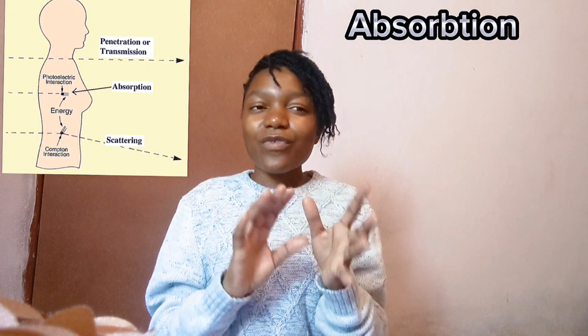So those atoms are the tiniest things. Just an atom in the body, which are very tiny in your body or my body, right? So the electrons or the energy or the X-ray or the photon, which is going to reach the body, I'm starting with the absorption part. So they will interact with an atom. For these ones, the absorption really interacts with the K shell, the L shell, right?